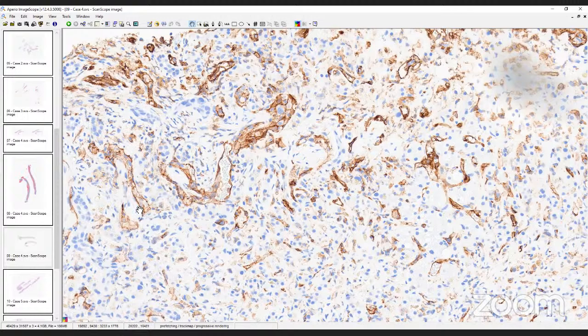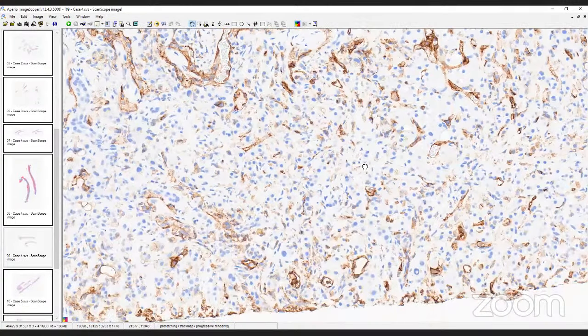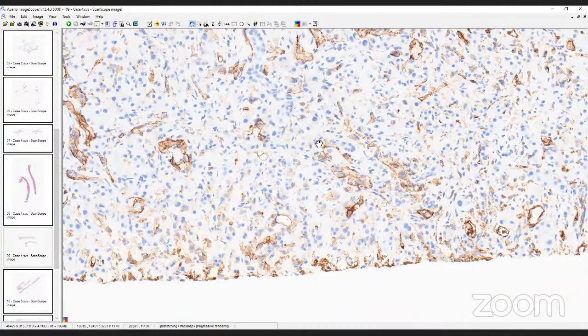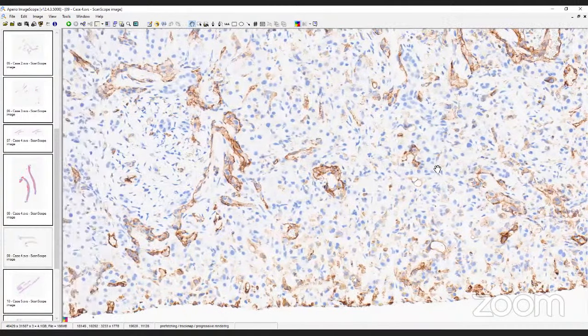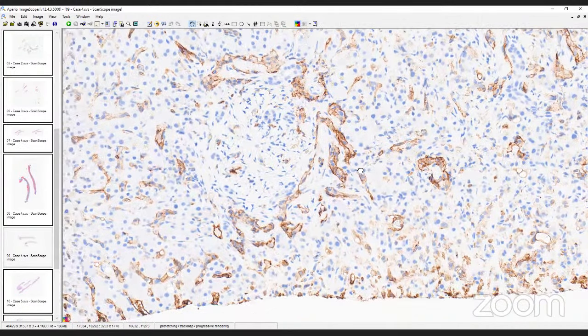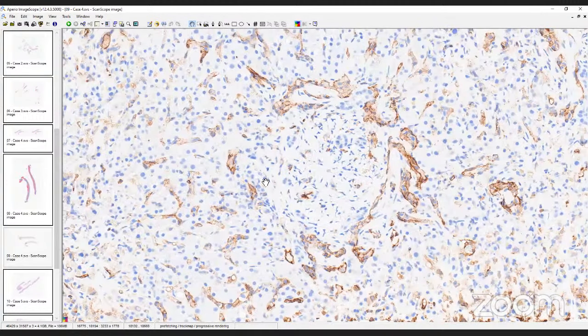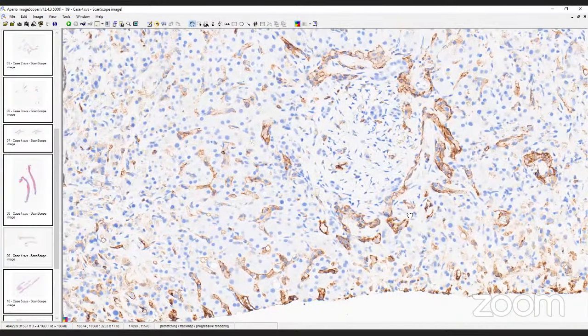There is another one over here. It's forming a sort of vascular structure out here. Look at that one. And then of course we have our single cells that we have seen earlier. Now, amongst all this, there will also be some pre-existing sinusoids, but that's not what we're focusing on. We are focusing on malignant cells that are marking for CD31. And here is a portal tract, and you see how it's going all around it. This is the normal small arteriole of the portal tract. Here's the bile duct, this is the arteriole, and the CD31 is marking the surface of those endothelial cells. But the rest of these here are all malignant.